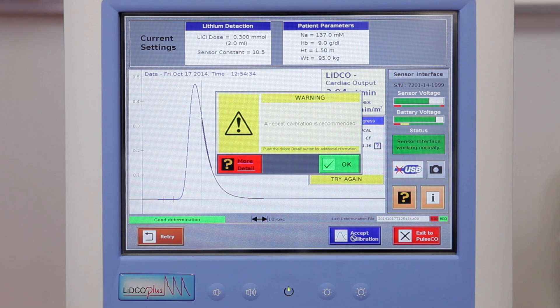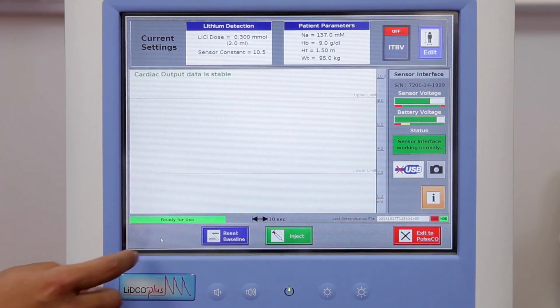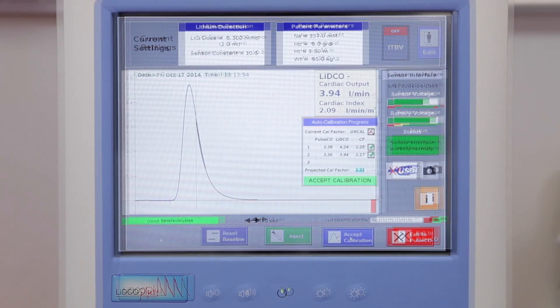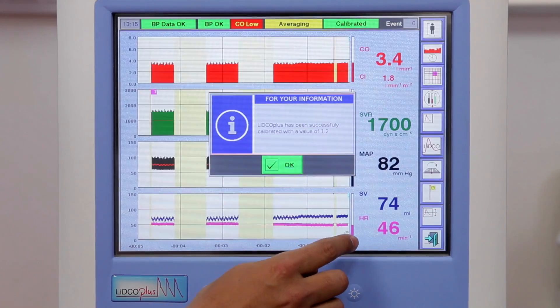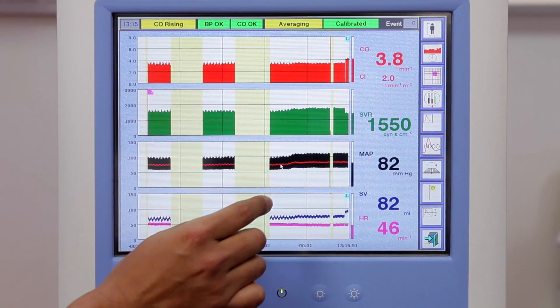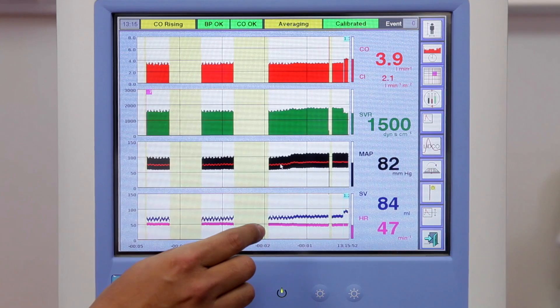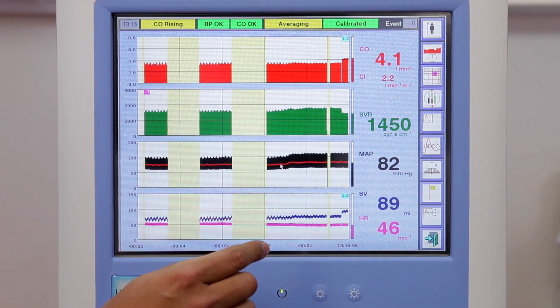Note: a second measurement will be requested if it is an initial calibration as shown. Press OK and select Retry and repeat the calibration. If the calibration factor is within 15% of the previous reading, press accept calibration. Press OK to return to the main monitoring screen. The LitcoPlus will now be calibrated with highly accurate absolute data and will normally need recalibration after 24 hours.